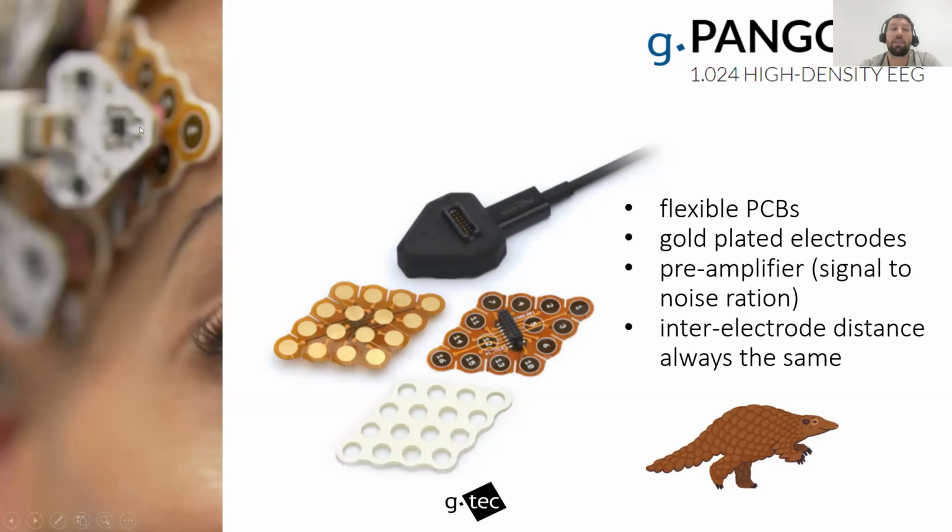And that's why, if you want to use it in EEG, you also need to shave hair. For example, in EMG or behind the ear, you can also use it here. And in that case, you attach the grid and then attach the preamplifier, and you can use the system. This is for one grid.